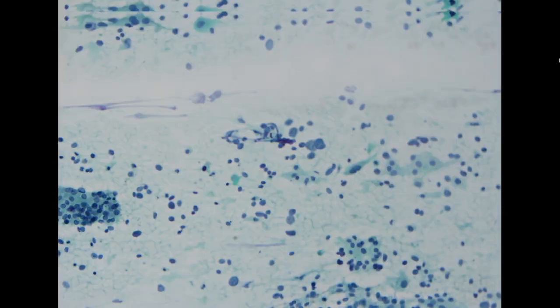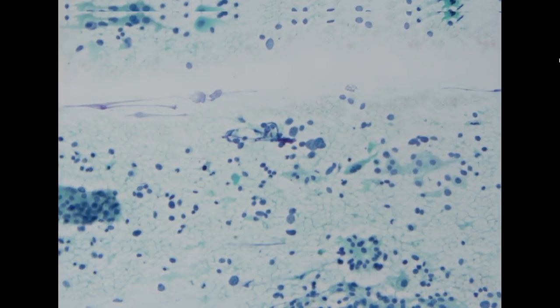If the entire specimen looks like this, we will be reassured that it is more likely an atrophic smear instead of a precursor lesion. So the distribution of the smear is very important.